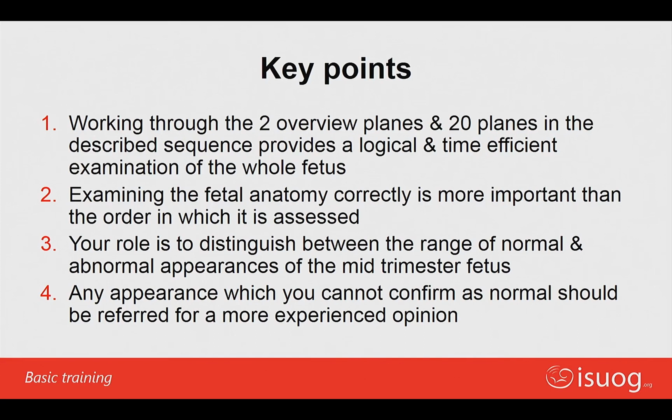And as I said before, I can't stress enough, your role is to distinguish between the range of normal and abnormal appearances. It's not to make a diagnosis. It's to know very well what's normal and what is abnormal, and whether something doesn't look normal because it's your technique, or whether it looks abnormal because it really is not normal. And that's where your skill and your experience will come in. And any appearance which you can't confirm as normal should be referred for a more experienced opinion, obviously.